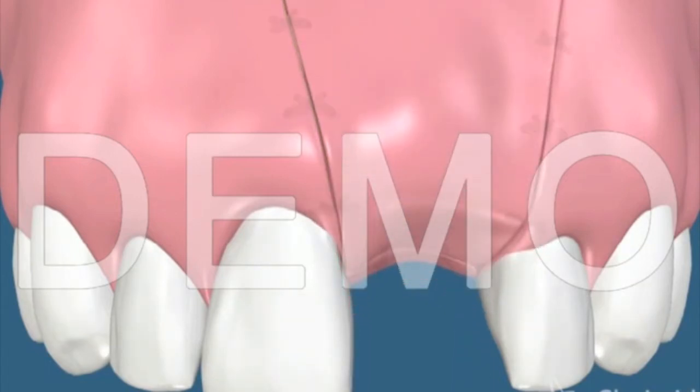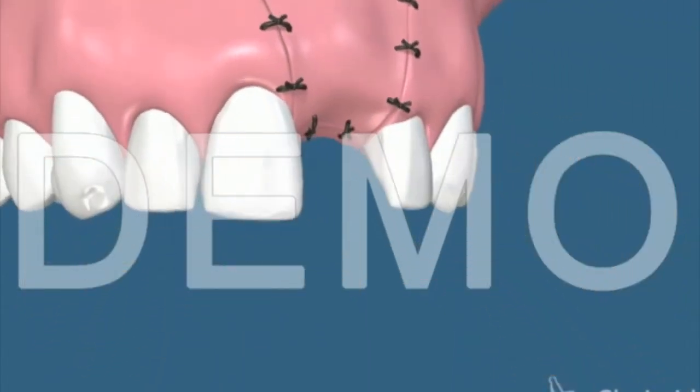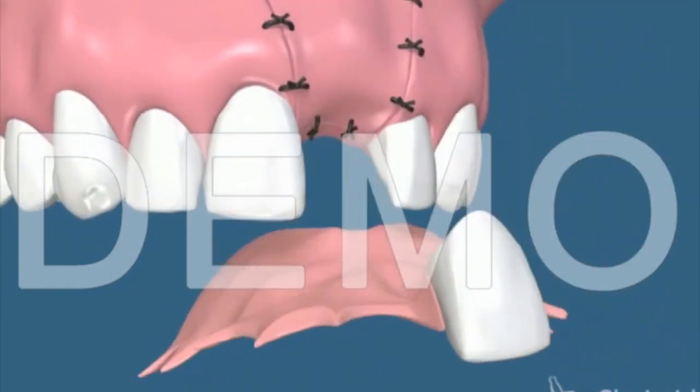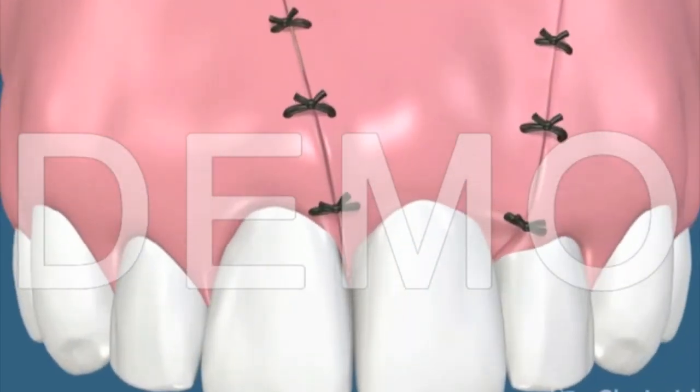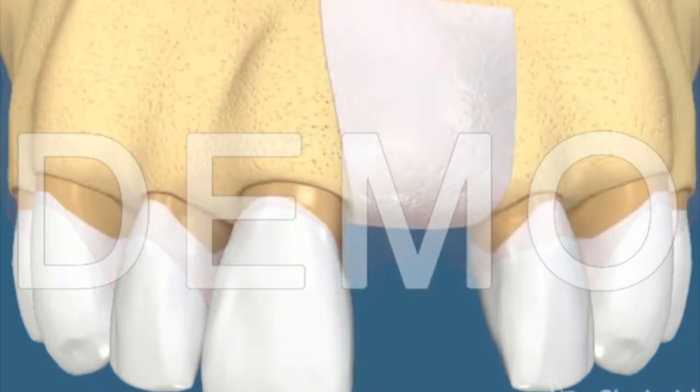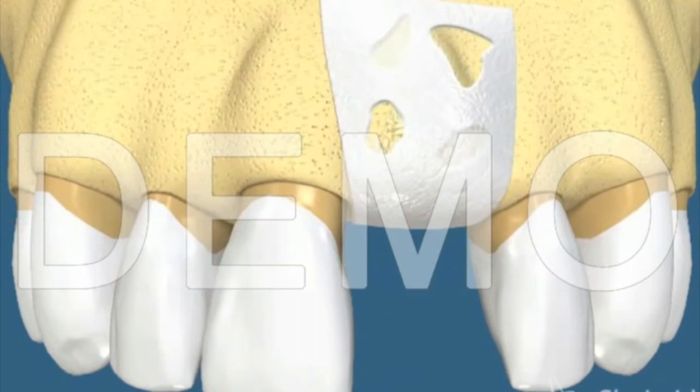The flap is repositioned and sutured into place. A provisional denture can also be inserted at this time to temporarily replace the missing tooth during this healing stage. The sutures are resorbed or removed, and the membrane underneath the gum tissue will resorb with time.